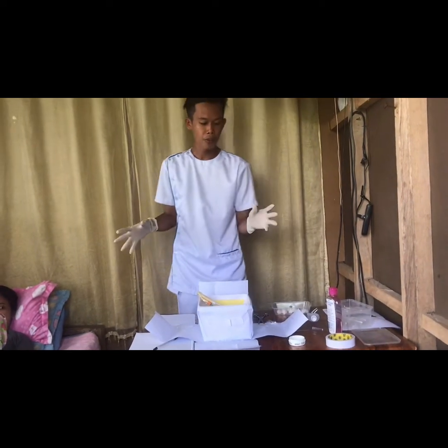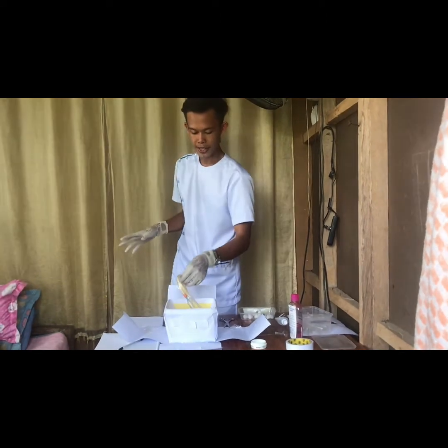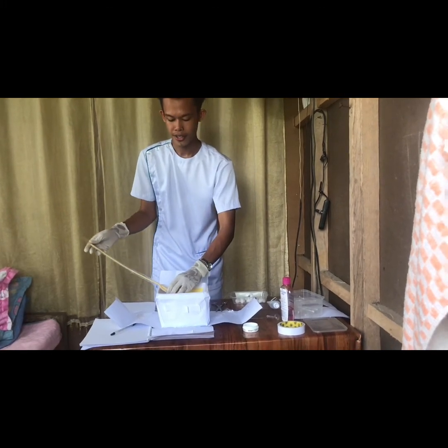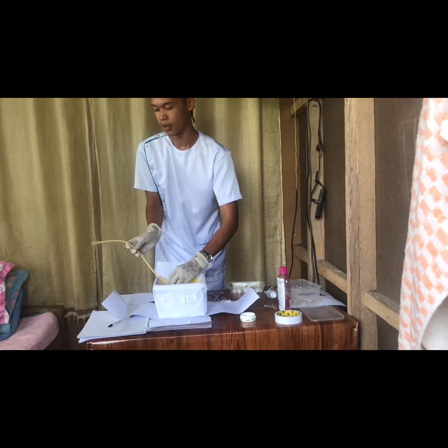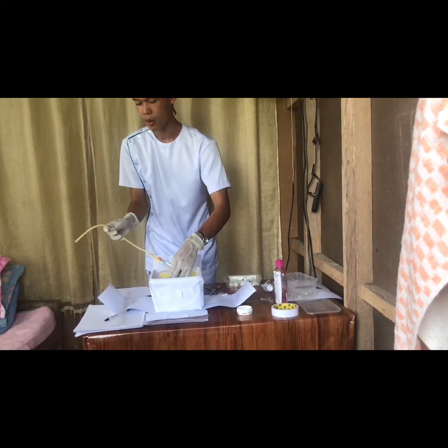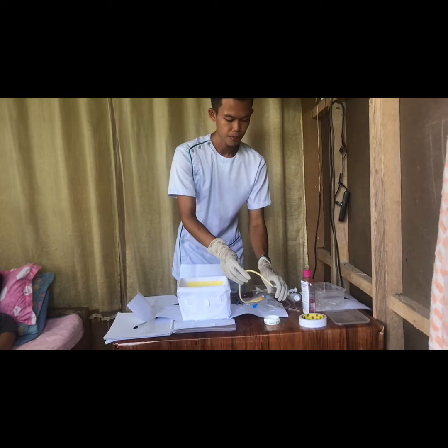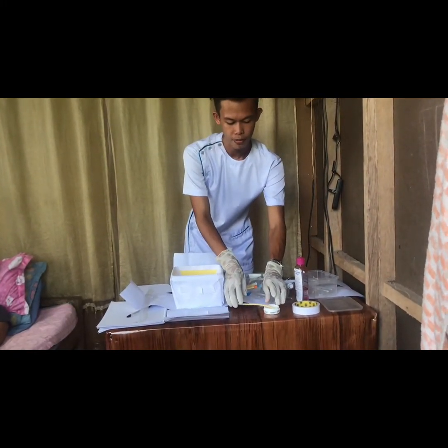And then after we have the small amount of the lubrication, I'm going to place the tip of the catheter in the lubrication in order to maintain sterility and to make it easier to insert. So this time, I'm going to hold the catheter 2 to 3 inches long and place the tip of the catheter in the lubrication.